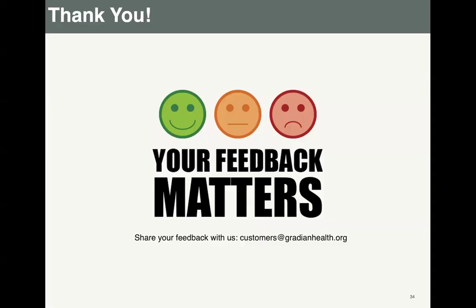That's the only thing I've encountered. And remember, that's not really the machine, it's someone missing it during the machine check, so do not forget to review and reconnect everything the way it should be. Otherwise, I don't remember encountering a real leakage from the machine.